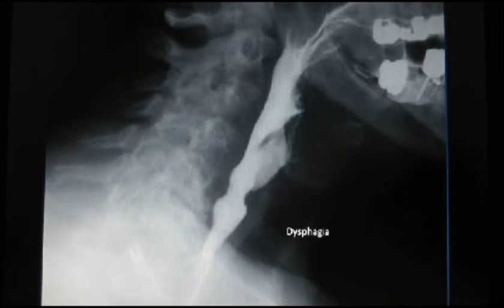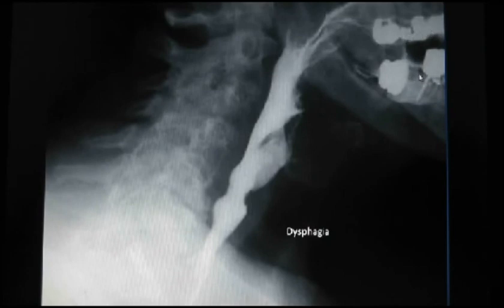So, can you tell everybody what this is, Adam? This is a single contrast swallowing study, a barium swallowing study. So the white that you can see in the teeth, again, just through x-ray, the stuff there that's bright is metal. And these are caps on his teeth. But what's white there is the barium that they're swallowing, because the barium is a big nucleus, and so it absorbs the x-ray, so the film doesn't get exposed. So it's filling the oropharynx, and then down into the esophagus. Right there is sort of the base of the esophagus, and up a little higher is the epiglottis. Thank you. And so the epiglottis is flipped forward to close off the airway, and is being outlined there, to make sure that the column of contrast goes down the esophagus.